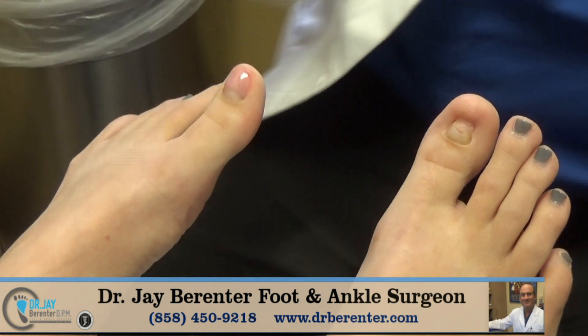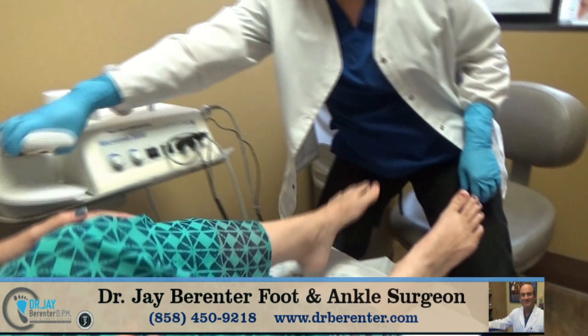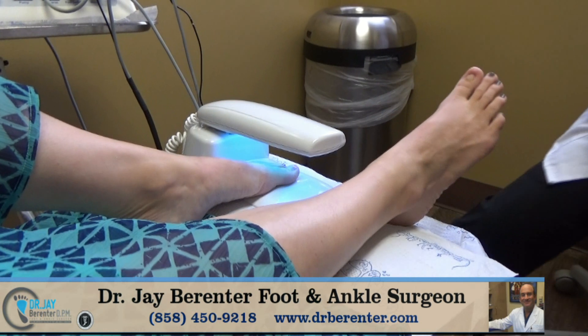So after each layer, we do have to put it in the UV light for two minutes. You can just have your foot in for two minutes.